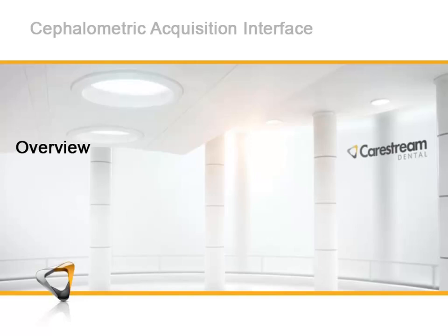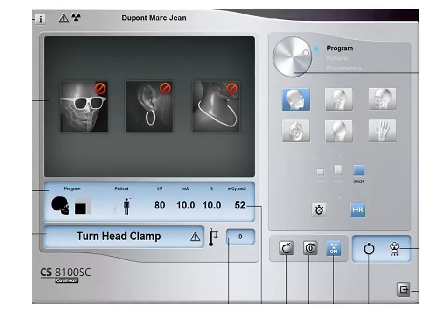Overview. Information button. Show versions. Identifies software and firmware versions. Resetting anatomy setting. Resets the manufacturing parameter settings. Memorize anatomy setting. Memorizes the user preference settings for each patient type, kV, mA, and seconds. Preview screen. Displays the acquired acquisition frames. Selected parameter display. Displays the current acquisition parameter settings.